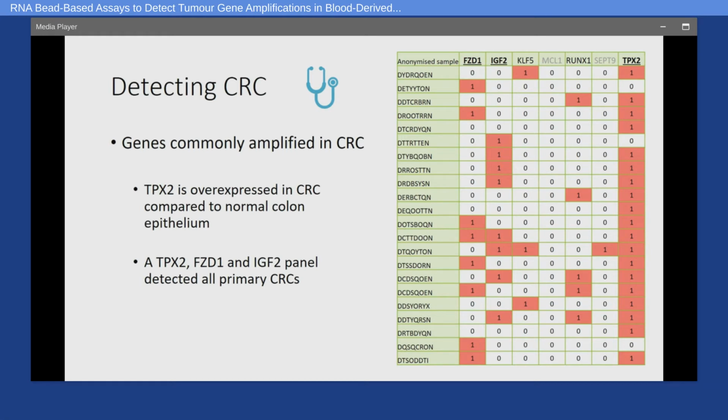This is a specific cohort of CRCs, and this is a patient cohort of CRCs, both primary tumors and matched biopsies from metastatic lesions. So it's really a very specific cohort, meaning that these have already had a metastasis. But we went back to the primary tumor, and also we actually had the metastatic lesion. Both in FFPE, so formalin fixed, paraffin embedded. It's good to say that with the QuantiGene assay we can actually run FFPEs, because we can actually read these gene amplifications and gene expressions in this case, using even degraded material.